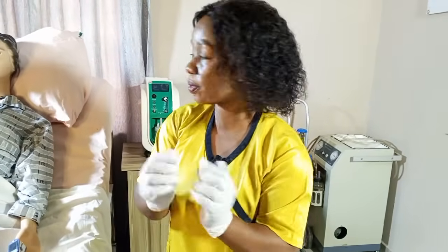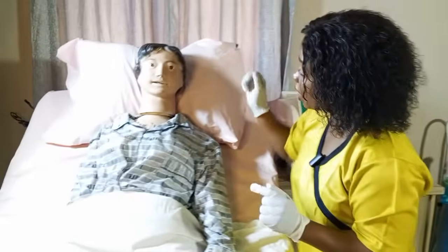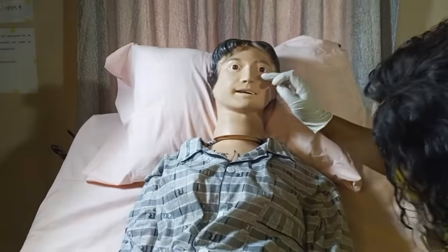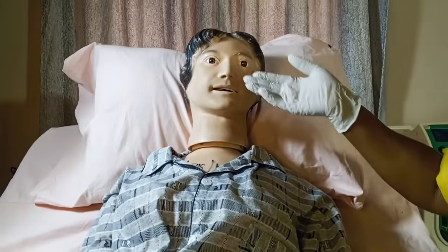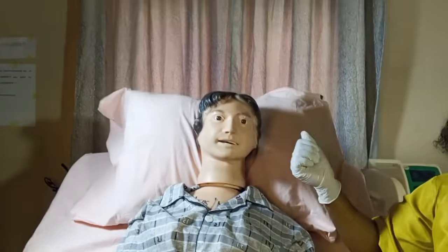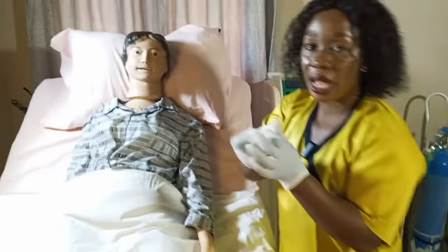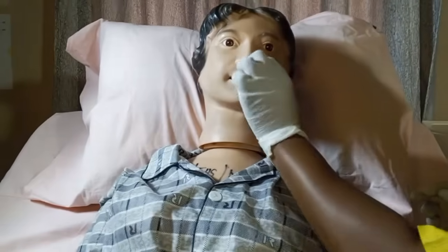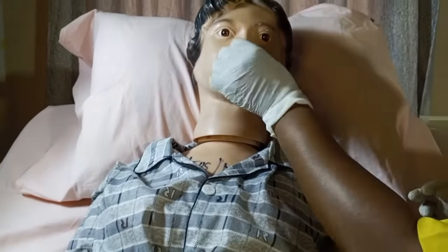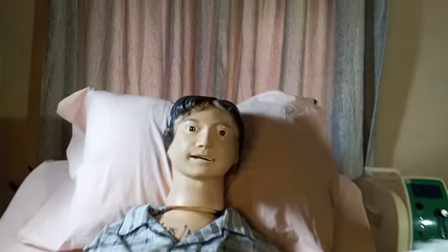After performing hand hygiene and donning gloves, I check my patient's nostrils for rashes, mucus, or anything blocking the nostrils. If there is anything there, I pick gauze to clean — if there is any mucus — to clean the patient's nostrils, then discard the gauze.